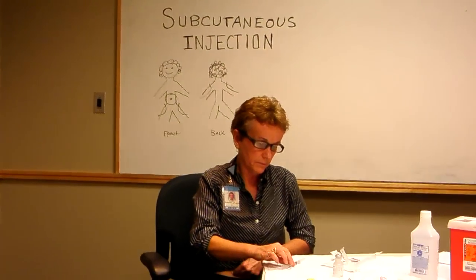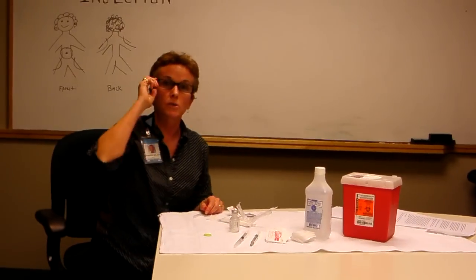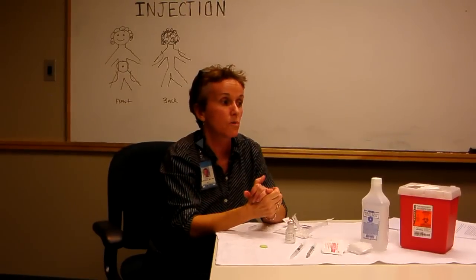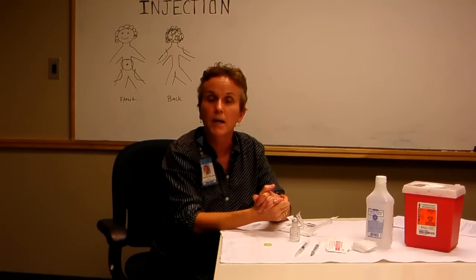Don't forget, when you're done, put your needles and syringes into a sharps box so you don't throw those in the garbage. You take them to your doctor, return them as directed.